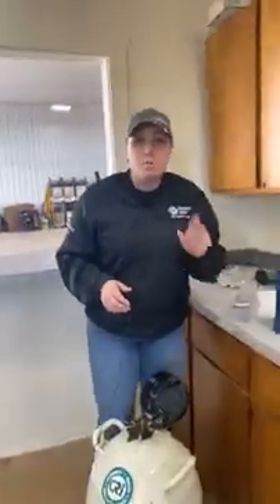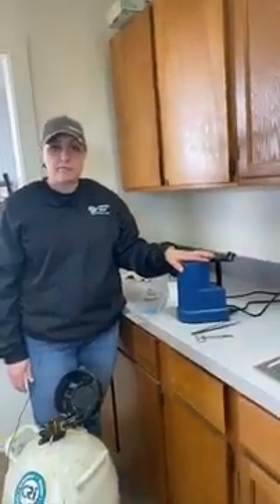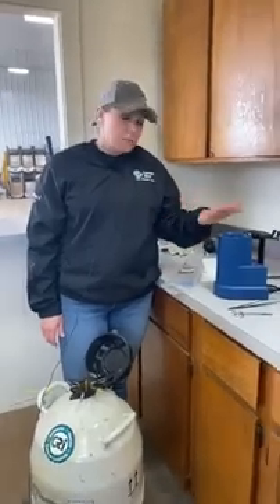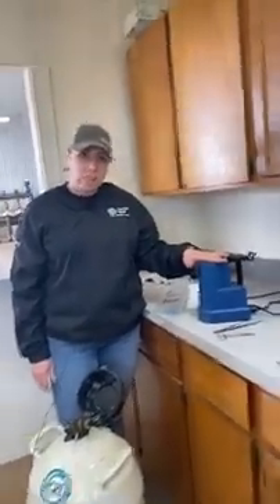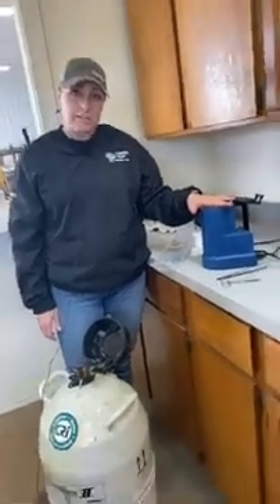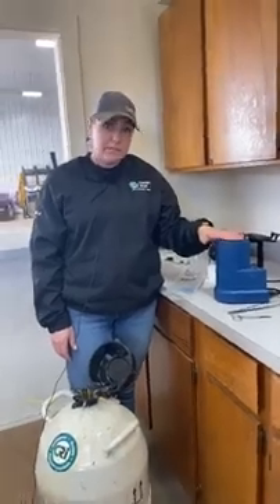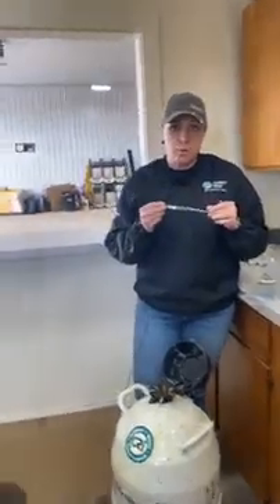One of the questions I got after last week's video was about thaw temperature for your water bath and time in the water bath for the quarter CC straws versus the half CC straws. That is all the same — we still recommend 95 to 98 degrees Fahrenheit water for the quarter CC straws, and 45 seconds in the water bath at a minimum. That's the same as your halves.